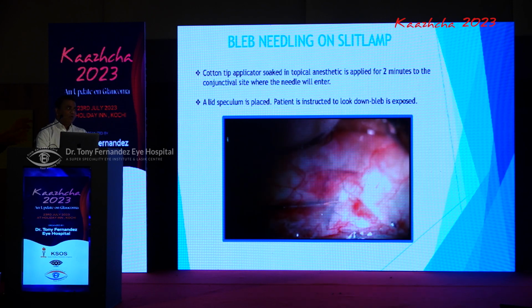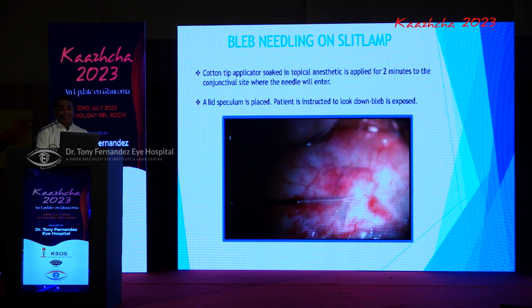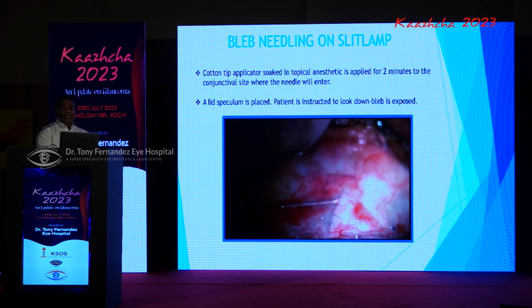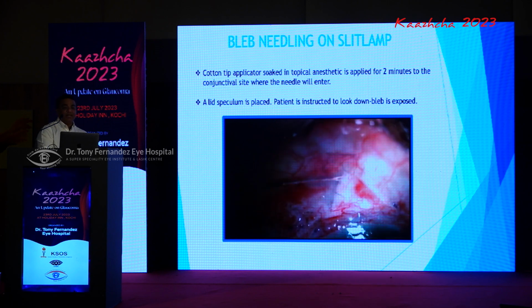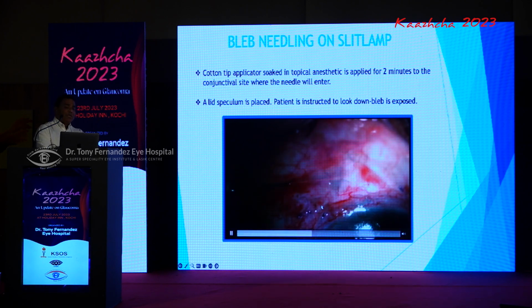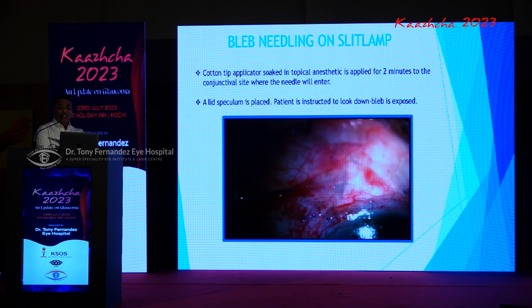But the patient has to be cooperative and you have to be a master in it. Then you can perform. I strictly say this technique really works when there is subconjunctival fibrosis or some subscleral fibrosis. So in this technique, first we lift the flap.